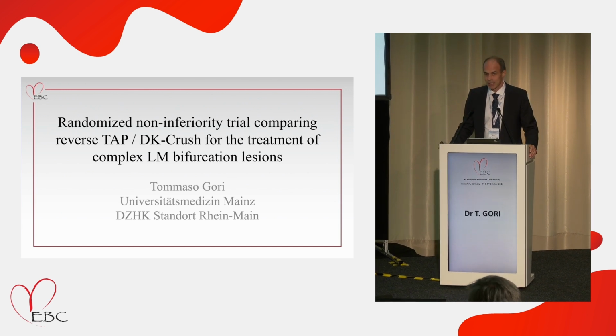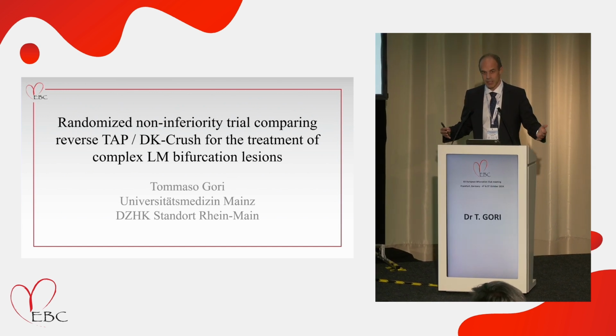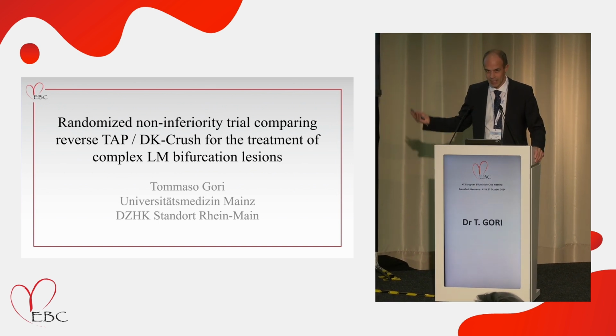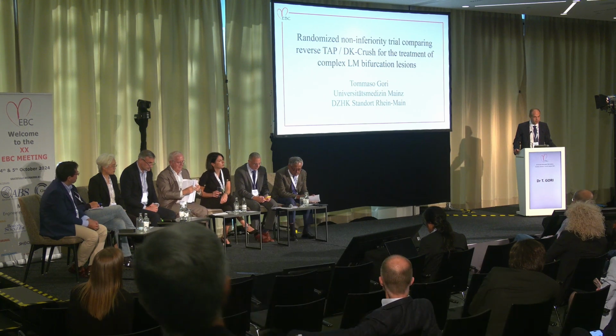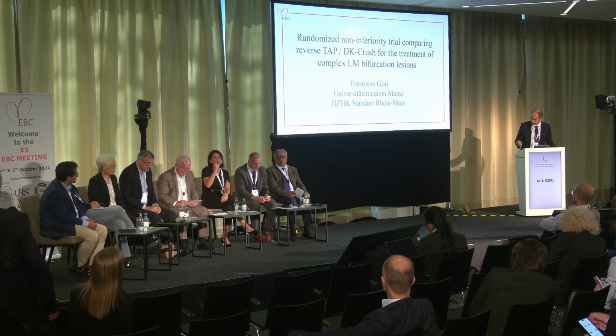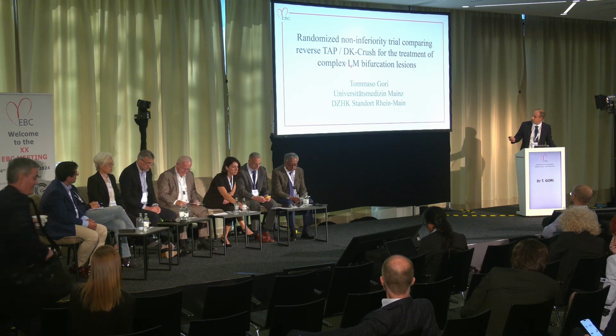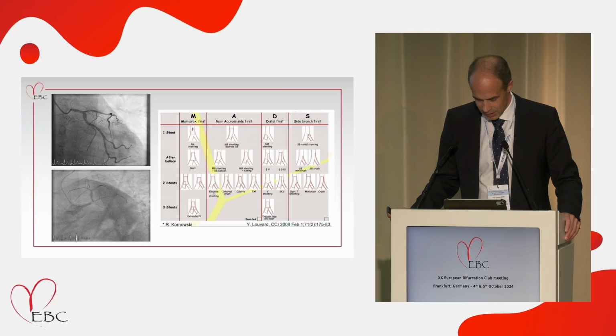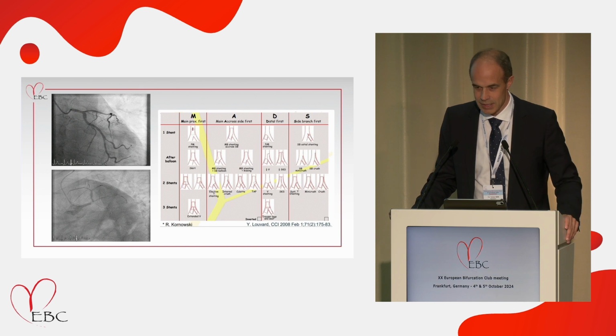The study is a comparison between DK crush, now become traditional, but at that time not so traditional, a technique for the treatment of complex bifurcation lesions, and a simplified version that I then called reverse TAP, which is actually some form of protrusion and flare technique, and then we can discuss the nomenclature and the semantics.